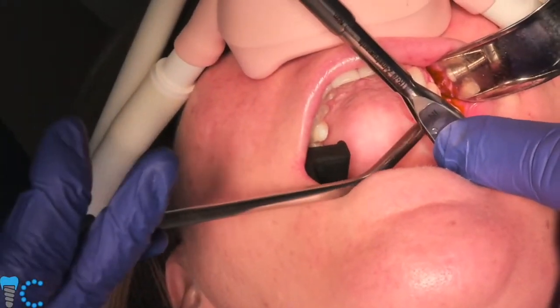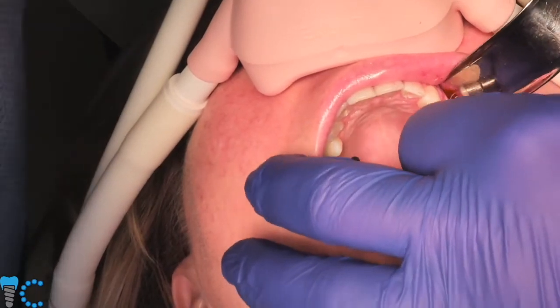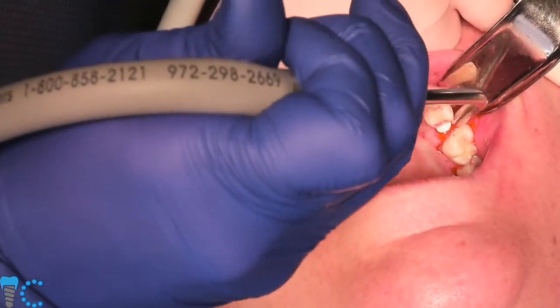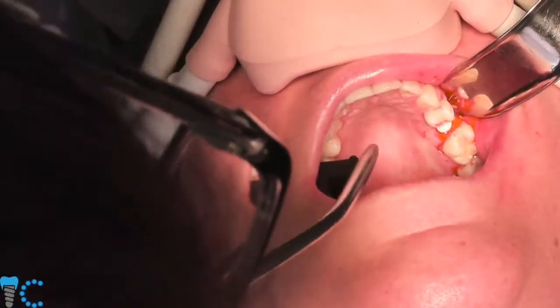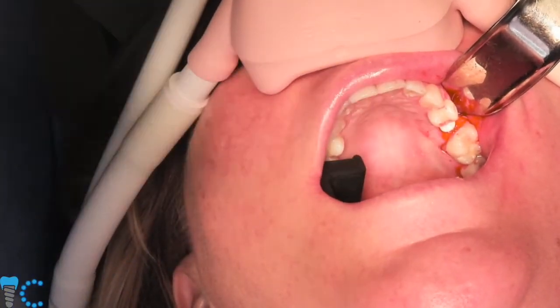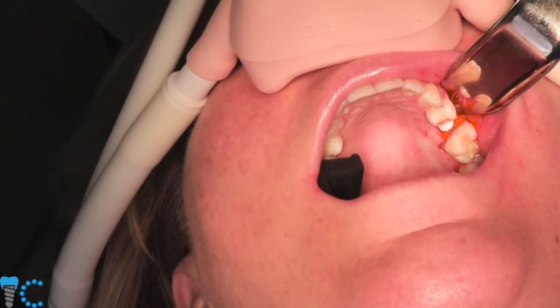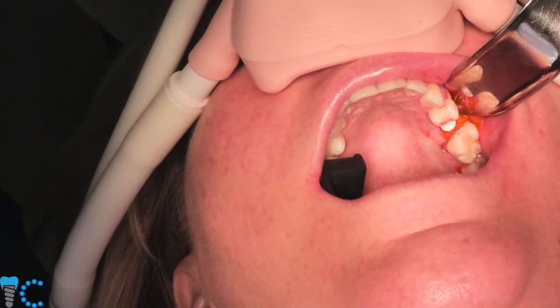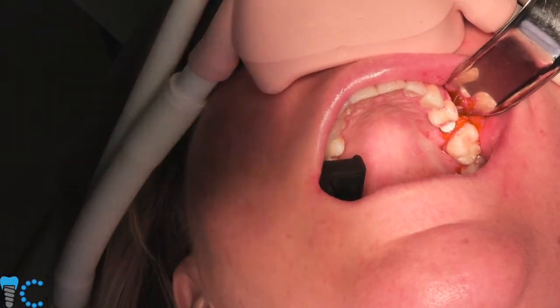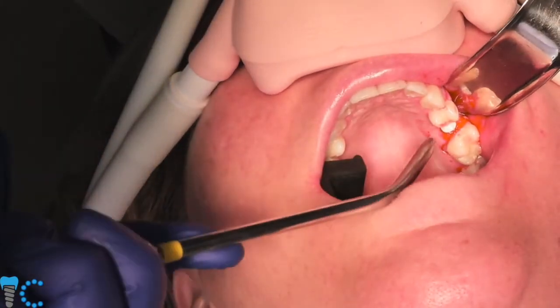So our implant's placed, and it looks really good here. So we can simply retrieve our instruments. Again, this is a tissue level implant, not a bone level implant. The collar is not meant to be buried all the way to bone. So our collar is sitting above the bone, and all we see is smooth surfaces around the sides. We have no thread exposure on this particular implant.